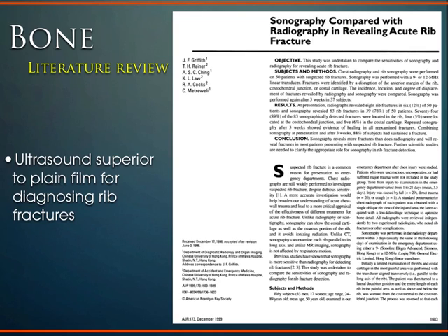I'll show you some more images of that, but again, when you look at the literature, because it is a new modality for imaging in MSK, a lot of people are trying to study this and make sure that we're not just assuming what we can see, making sure we're comparing to standard of care, whether it's X-ray or MRI or arthroscopy, making sure that what we think we're seeing, we actually are seeing. And most of the studies that are coming out are showing quite a benefit to ultrasound, and that it's either as accurate or in some cases even more accurate than some of our traditional modalities.